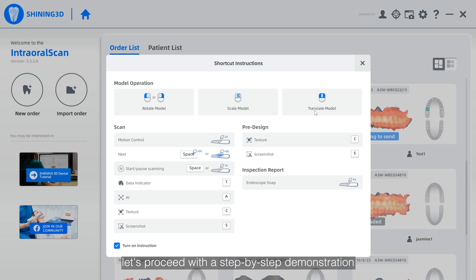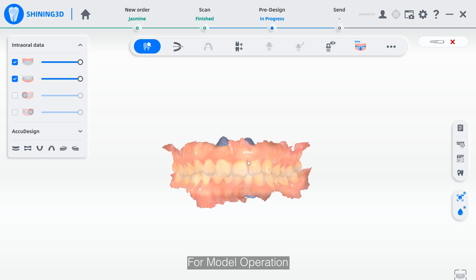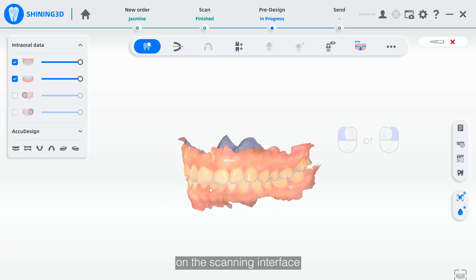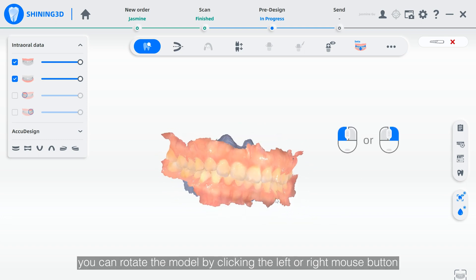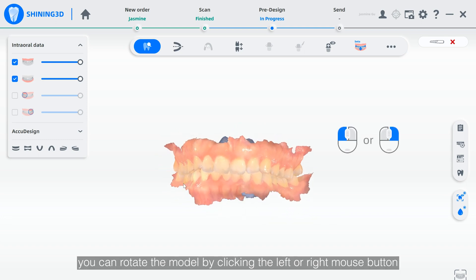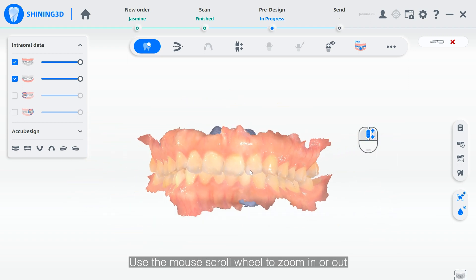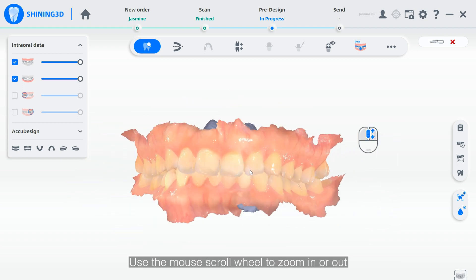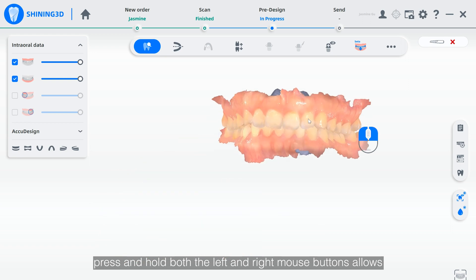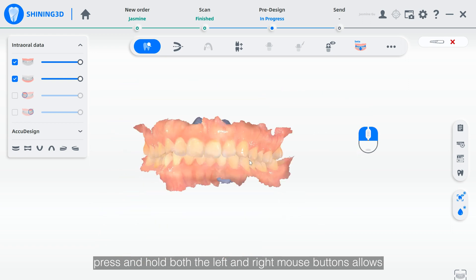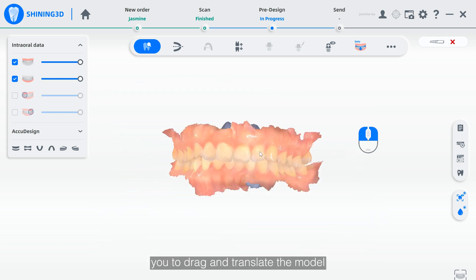Now, let's proceed with a step-by-step demonstration. For model operation on the scanning interface, you can rotate the model by clicking the left or right mouse button. Using the mouse scroll wheel to zoom in or out on the model. Press and hold both left and right mouse buttons to drag and translate the model.